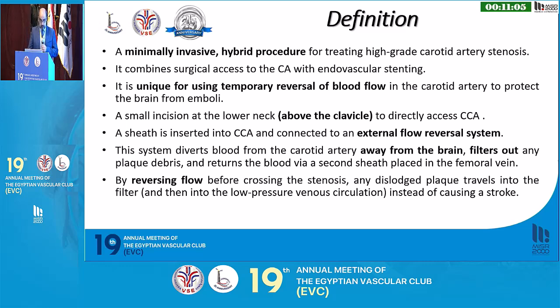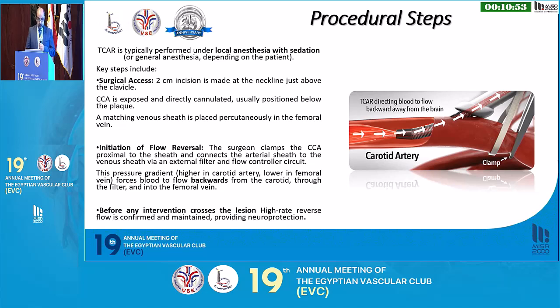By this unique reversing flow technique, when crossing the stenosis, any dislodgement of the plaque travels into the filter instead of causing a stroke. The TCAR is typically performed under local anesthesia and sedation or general anesthesia according to the patient's condition.